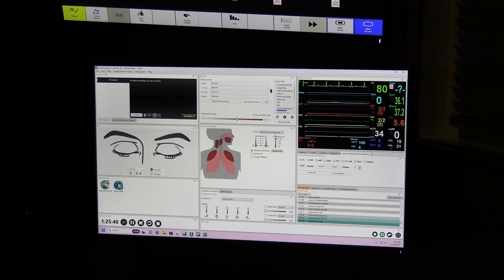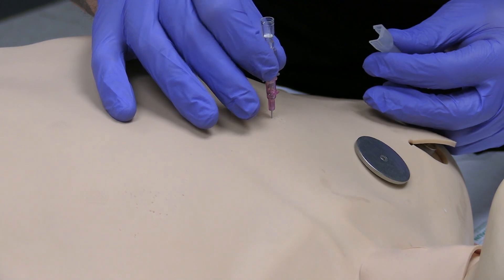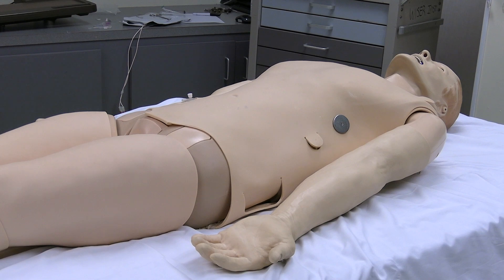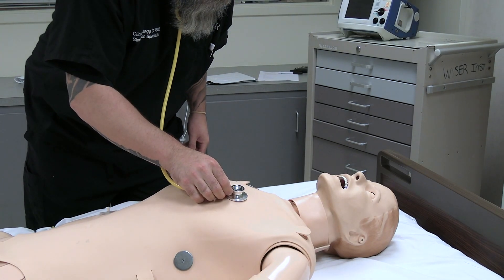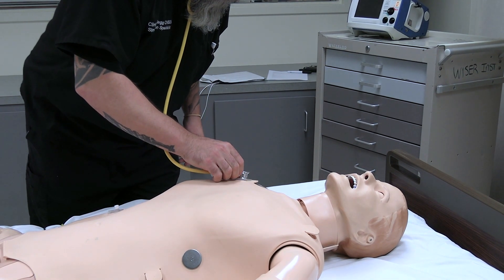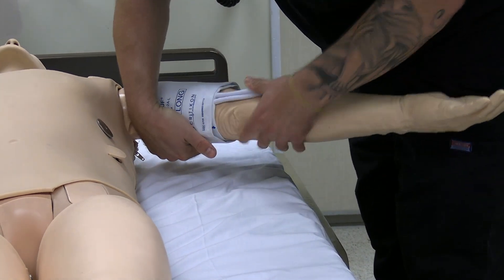Airway resistance and lung compliance can both be simulated and controlled via the software. Simulating a pneumothorax can also be set up and relieved with real needle decompression. SimMan 3G also has a seizure feature. Heart and lung sounds can also be heard with a stethoscope and customized for any particular condition.